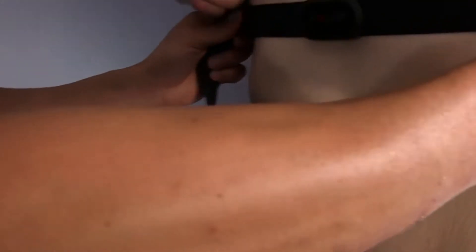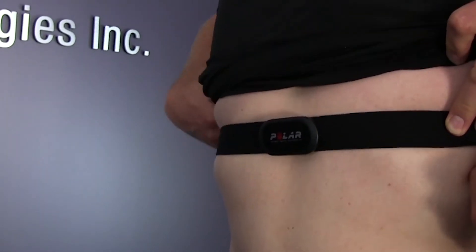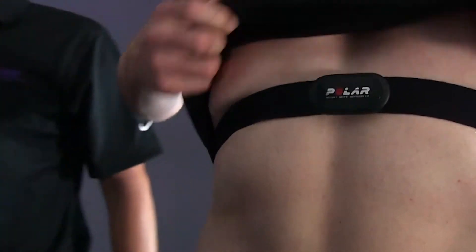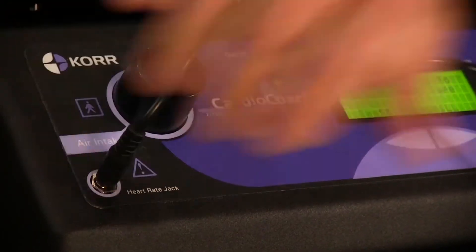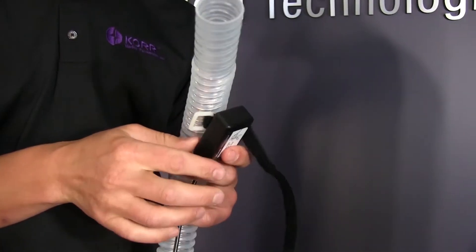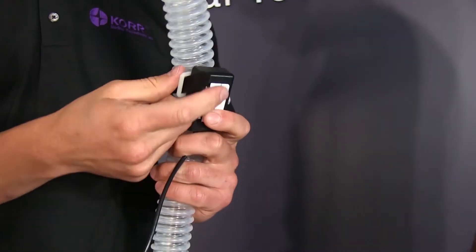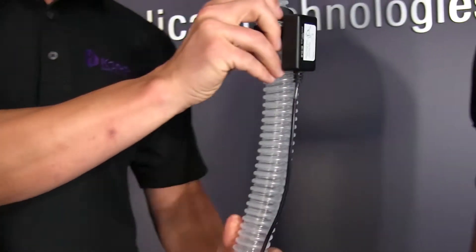Wet the grooved electrode areas on the back of the strap with electro-lubricating gel to help produce conductivity. Secure the strap around the client's chest directly over the xiphoid process, or right under the pectorals. Adjust the strap length so the fit is snug yet comfortable. The wet electrode areas should be firmly against the skin with the Polar logo in a central upright position. Now plug the heart rate pickup into the heart rate jack on the front of the CardioCoach. Using the Velcro straps, attach the VO2 hose approximately 8 inches from the top, making sure the wire is facing downward and the white label is facing the chest.